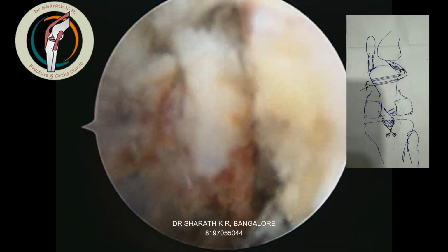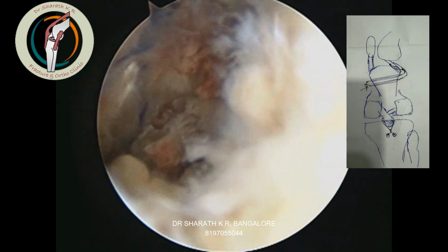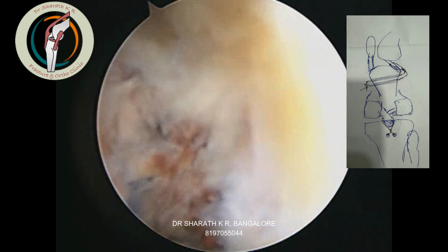The most important thing is to create two portals, and then you can see now the V-shaped two threads going in two tunnels nicely, the same way as we have demonstrated in the schematic diagram. The same way it is done.